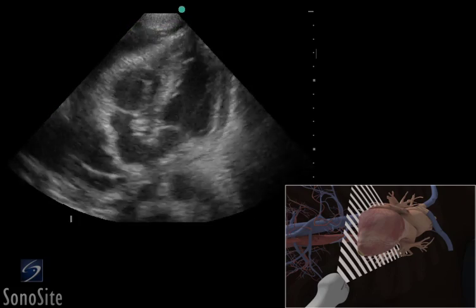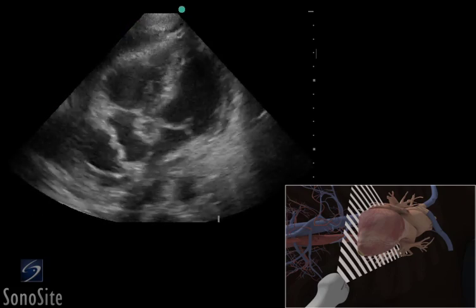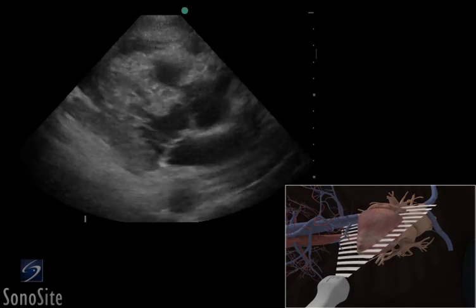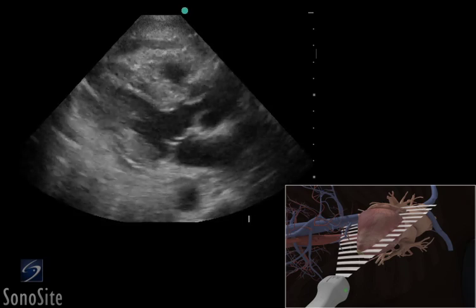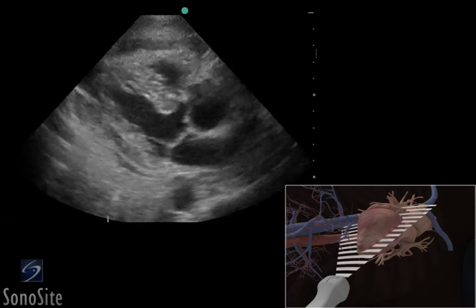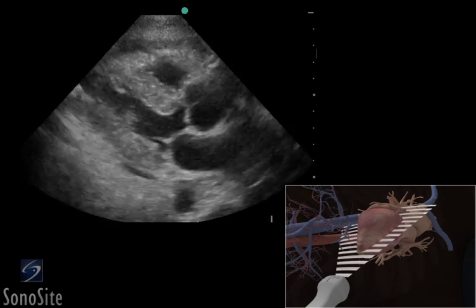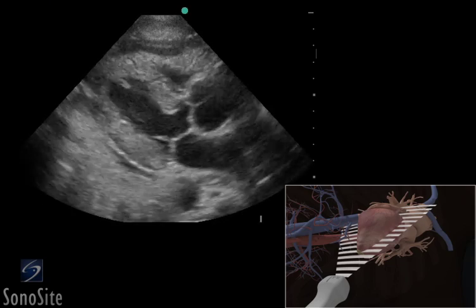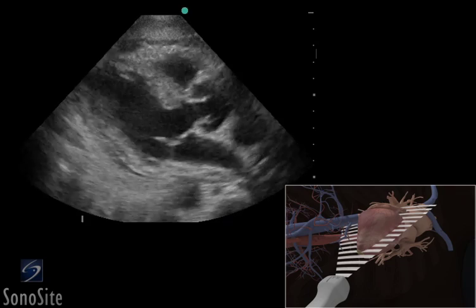For direct needle guidance using an in-plane technique, the transducer is rotated 90 degrees counterclockwise so the orientation marker is at the 12 o'clock position. This will create a view of the heart that is between the apical four-chamber and parasternal long axis views. Note the absence of the lung to ensure it is not in the needle path.